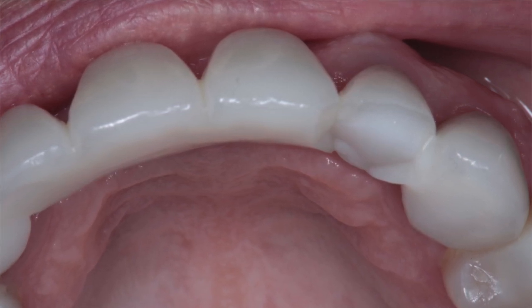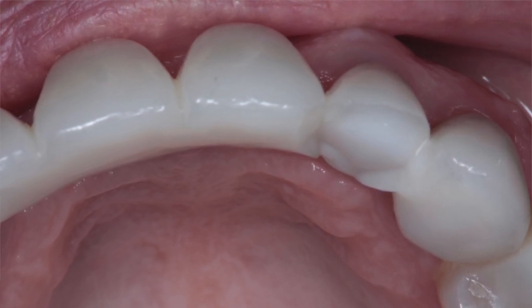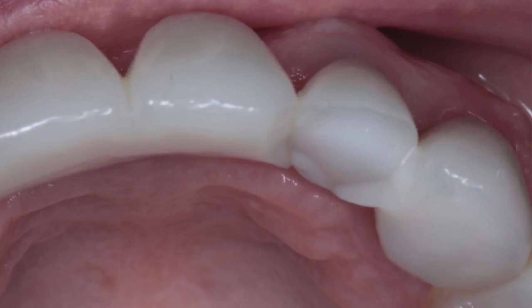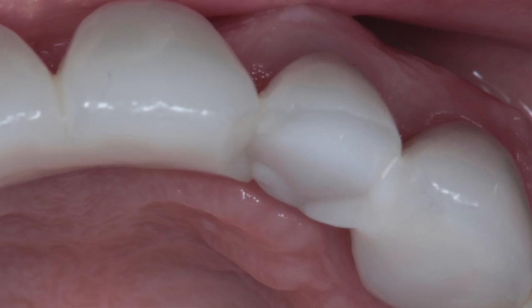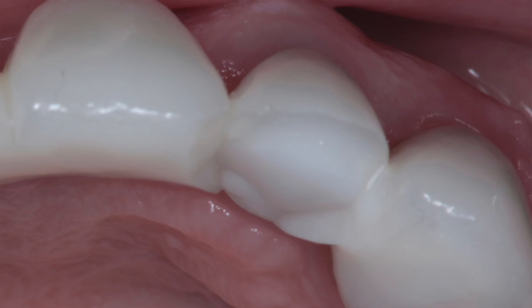So I find these kind of cases challenging, but also they're interesting because I always like to see if I can use CEREC and repair something like this. So my thought process was I'm just gonna kind of smooth out some of these crack lines or the fracture lines and maybe place a slight bevel on the buccal surface.